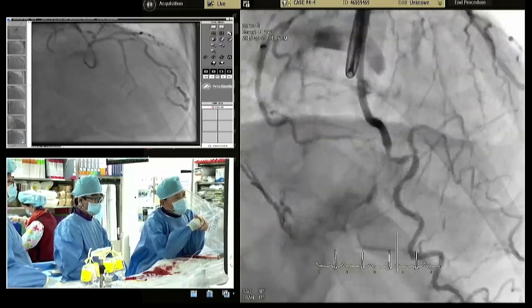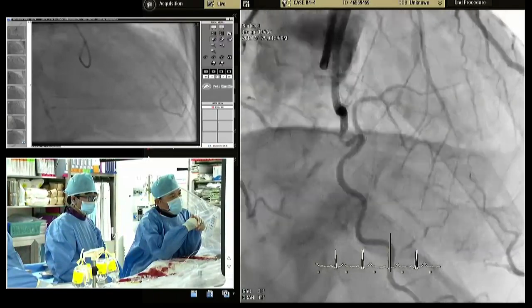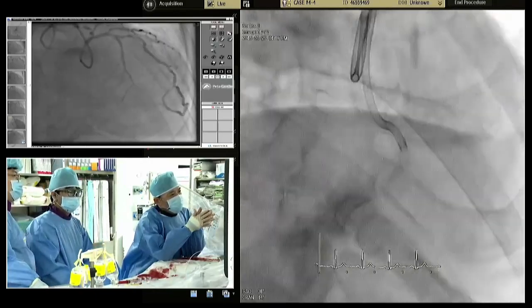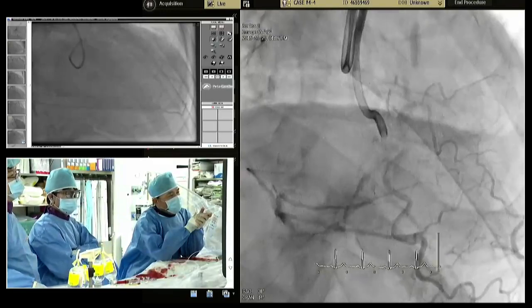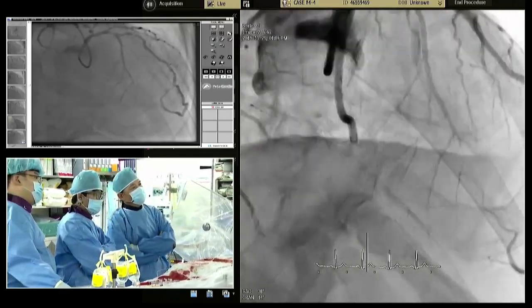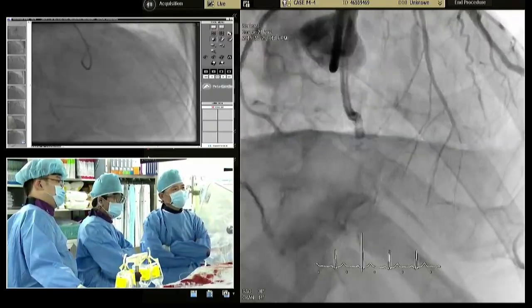We would like to ask the panelists about the procedure strategy. Anyone want to comment? It seems like the proximal cap is kind of there, but a bit ambiguous exactly where it takes off. There's maybe a possible channel. But what would people try? Antegrade first, or IVUS guided?